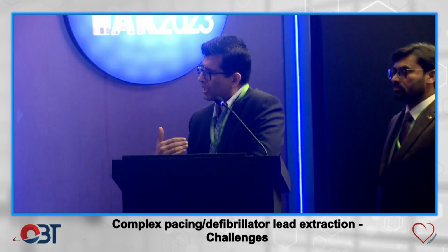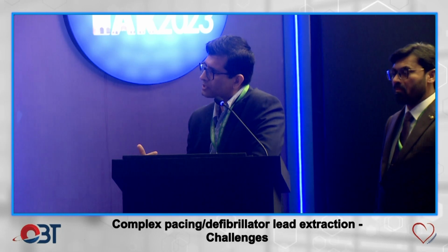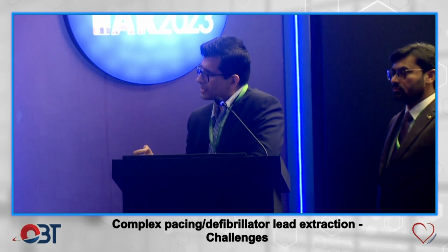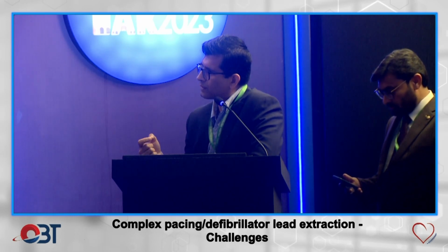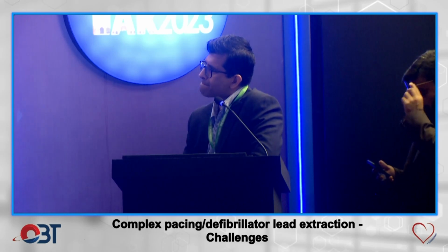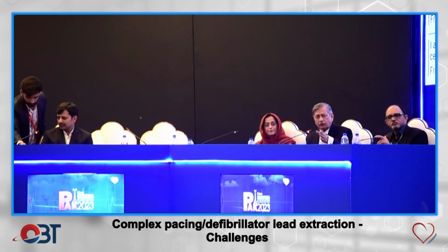For example, if I quote my experience, we have extracted 80, and out of those, we experienced perforation in 2 of them. So perforation, yes, it can occur, but we can significantly reduce its incidence if one is appropriately trained and careful. So do you actually burn it out circumferentially, or you just burn it out on one side?